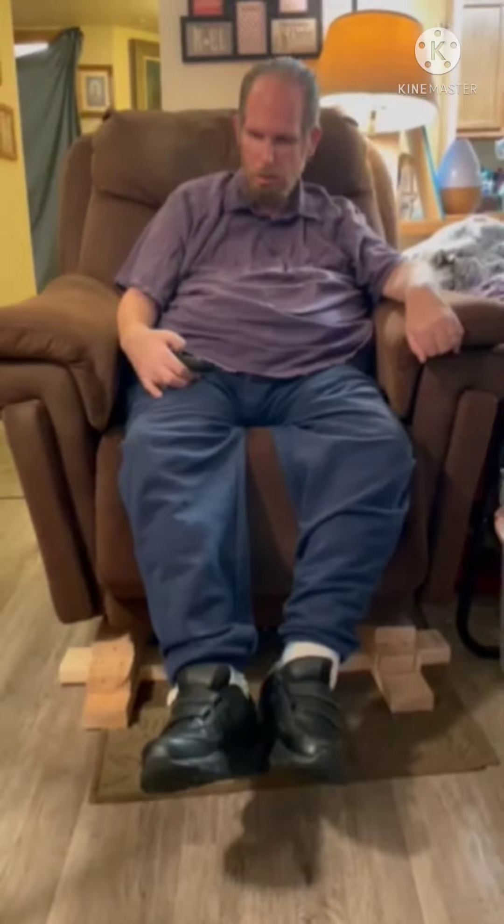Alright, so now I'm in the chair. This is how the lift chair is supposed to be.